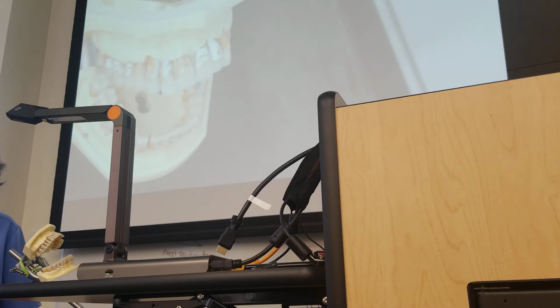Do we do the horizontal stroke subgingivally as well? Okay, this is a good question, you guys. This instrument is always subgingival. The sickle is on the enamel, so that's supra. This is subgingival, so this is always going to be from the CEJ down to the base of the pocket.